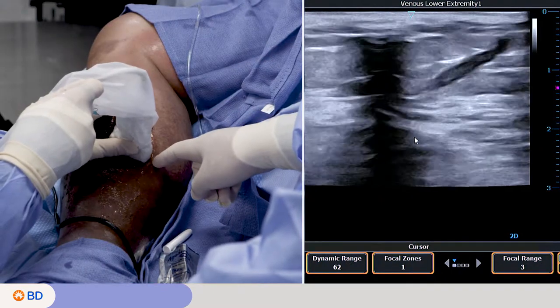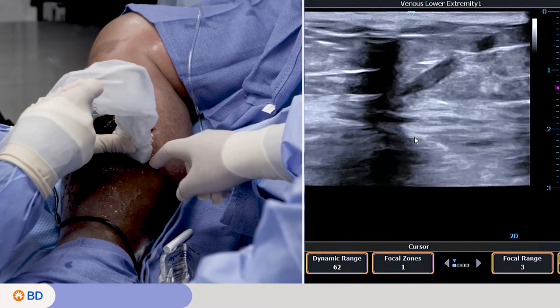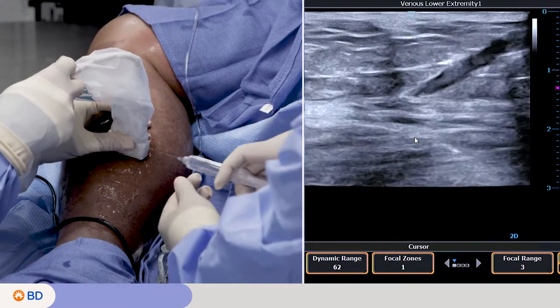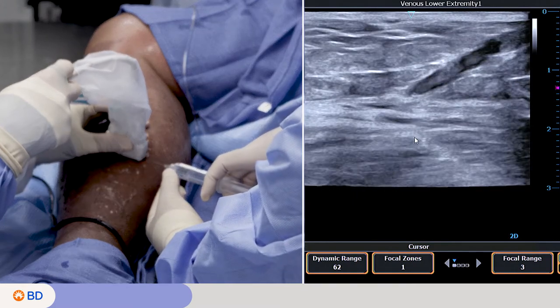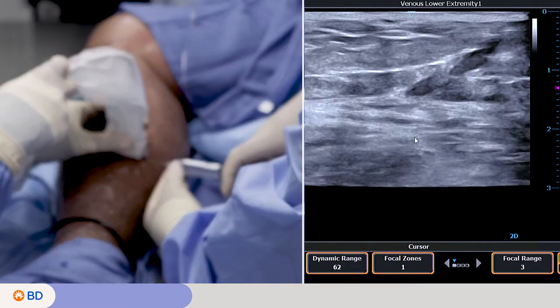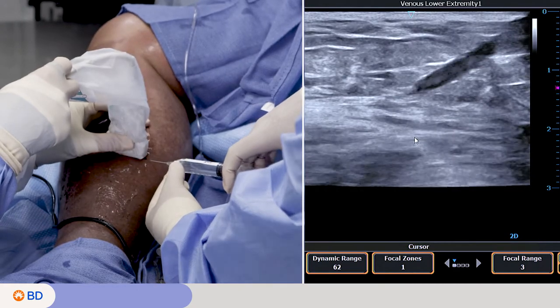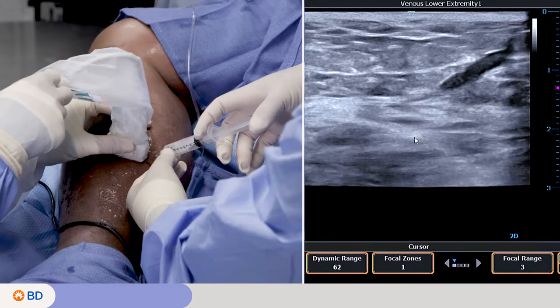Use duplex ultrasound to obtain a clear view of the incompetent perforator vein at the level of the deep fascia and deep venous system. Line up the perf to the corner of the ultrasound screen in longitudinal view. Ensure the skin is marked where the perforator is located prior to treatment, and ensure the probe is perpendicular to the skin. Administer local anesthesia to the access site.